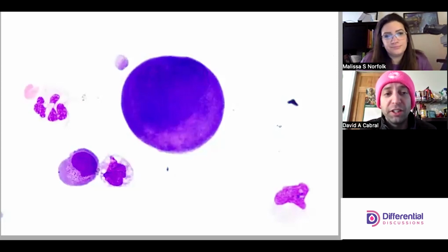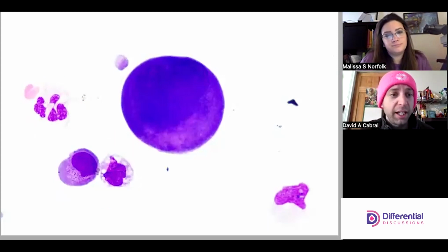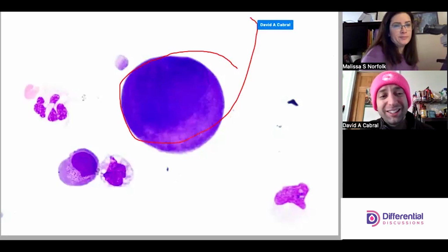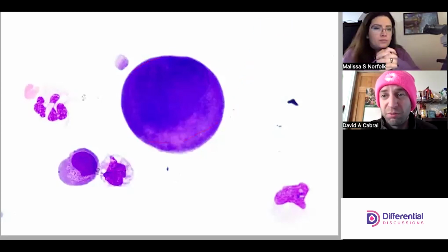This stain and the preparation is QC'd right here. We can see normal hematopoietic cells staining the way I would expect them to stain. I can even see a little beat up red cell here. So I'm seeing all parts of the right stain behaving exactly the way I want it to behave, and then you have this right next to it that's just this mess. Remaking the slide's not going to do anything. This is a finding and you should deal with it.